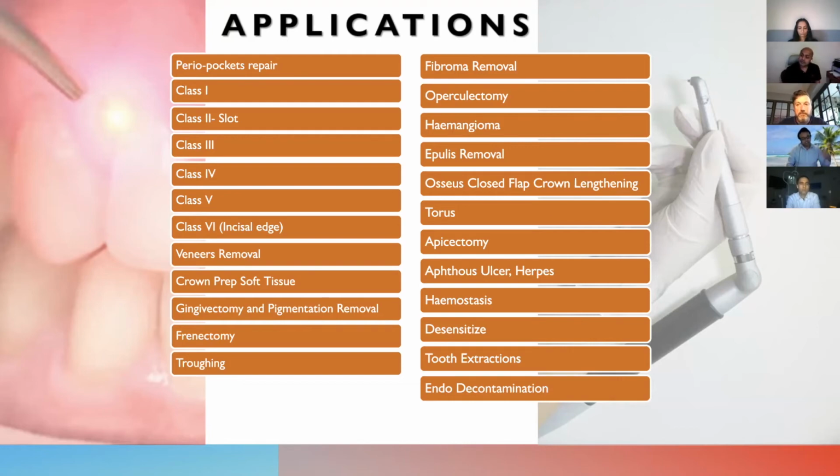So you're saying that if the patient had an Emax crown, and for argument's sake had gone into pulpitis, you could remove the crown, do the root canal, and refit the same crown provided the margins are intact. Is that correct? Yes, that is right. That's really good. There are so many wonderful things that can be done. This is one aspect of it, what you picked up. And the reason I put this list is that for each dentist there is a part somewhere here which is their space. If they know how to use lasers in that space, that would change the way they do dentistry, and change the perception for the patients as well.